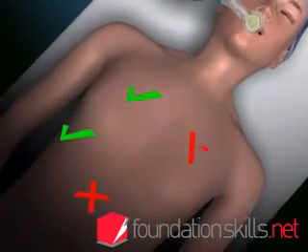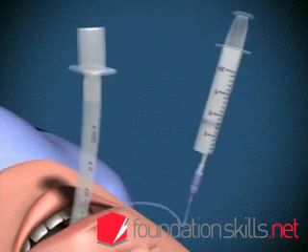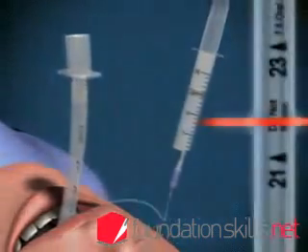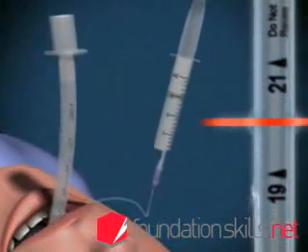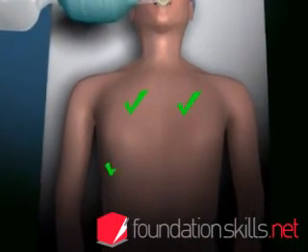If the tube is in too far, the right lung will be ventilated only via the right main bronchus. If this occurs, deflate the cuff and withdraw the tube two to three centimeters, then reinflate the cuff and recheck the position.